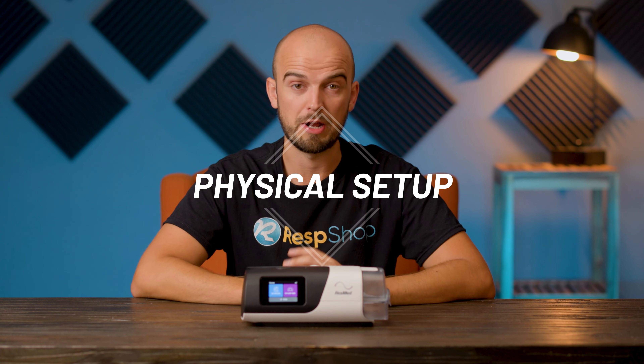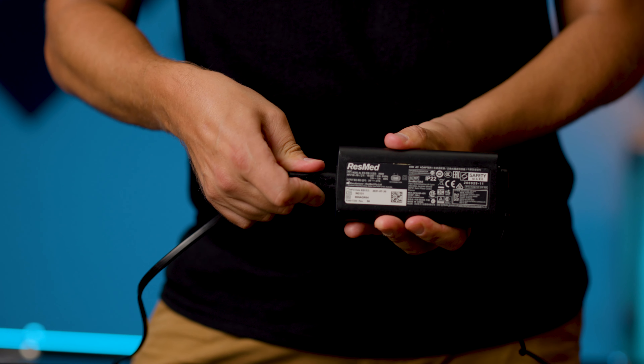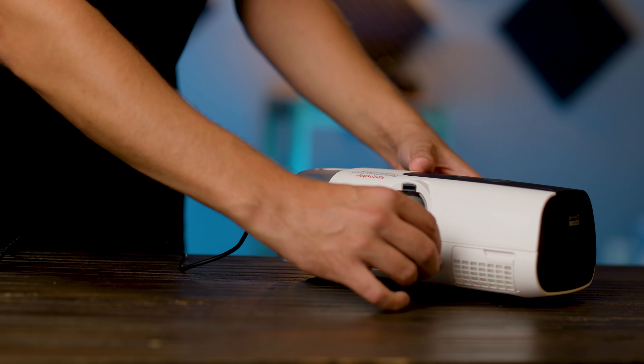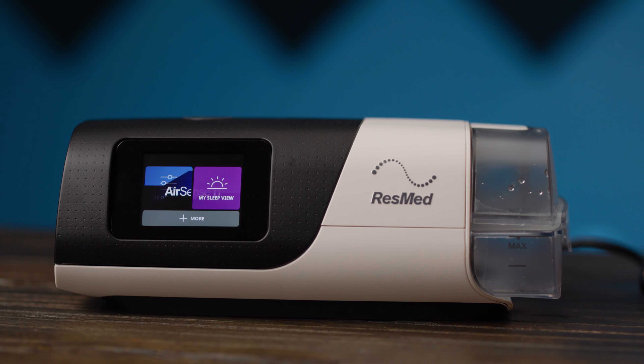To start, let's get everything in its right place. The power cord comes in two parts. One part includes the power block, and the cable from the block should be plugged into the back of the unit, below and to the right of the large air connection point. The other part plugs into the wall, and then into the block.